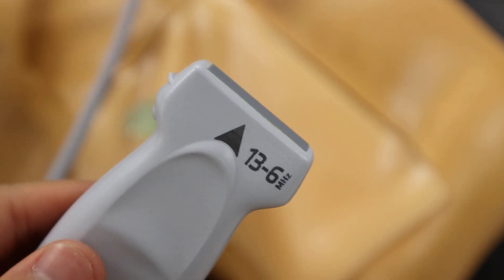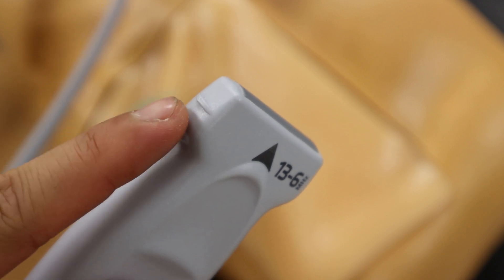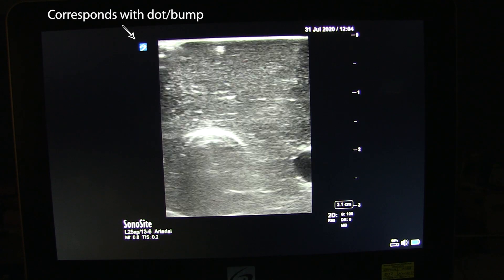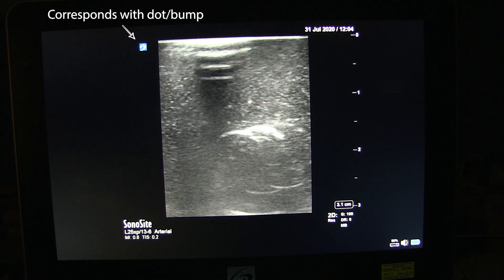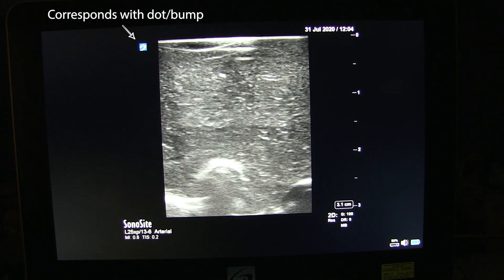Before you even put the probe down on the skin, look to see what side of the probe has the little dot or bump. The dot or bump marks the left side of the picture on the screen. Always orient the probe so the dot is facing to your left or toward you. If you don't, things will look backwards.